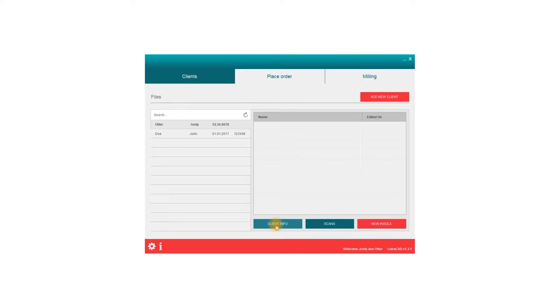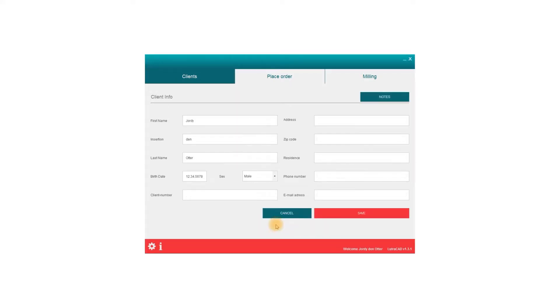To change client information, select Client Info, Change or Add Information, and click Save to keep your changes, or Cancel to return to the previous screen.